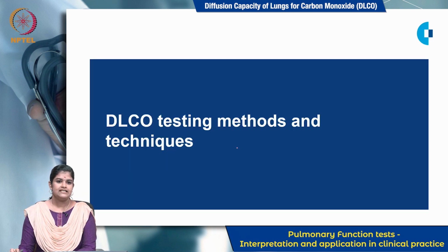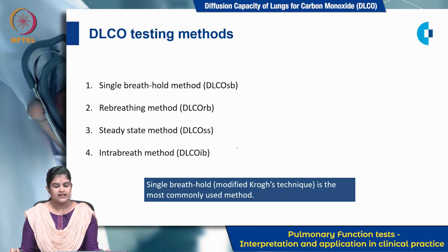Now let us see the DLCO testing methods and techniques. There are various methods available, which are the single breath hold method, rebreathing method, steady state method and intra-breath method. But the most commonly and widely used method is the single breath hold method, as this method is widely accepted by various international societies. It is very standardized and has reference values in the literature, and it is comparatively easy to perform. So henceforth we are going to see about the single breath hold method.